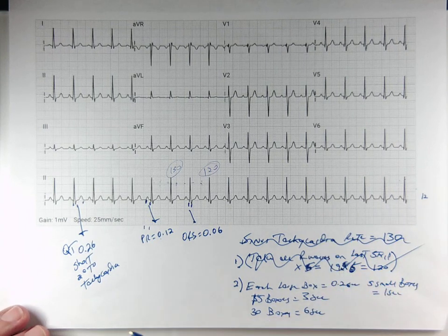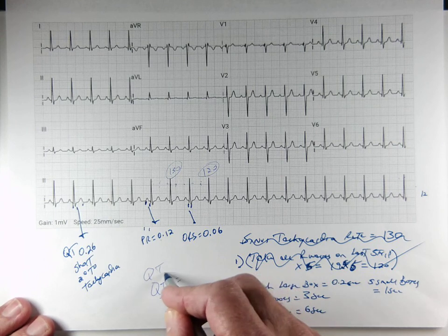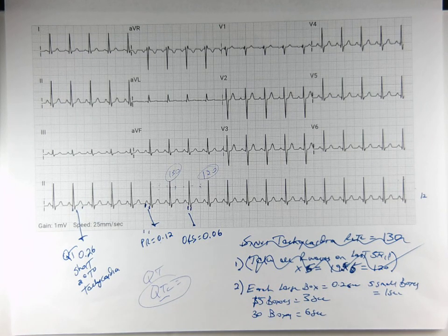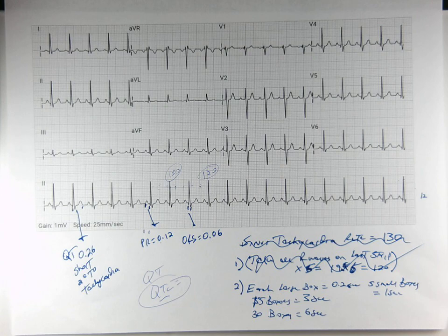And so when you get a printout from the EKG, you'll see up on the top, it'll say QT, it'll say QTC. The QTC is corrected by the machine for the heart rate. And we're generally in that 0.36 to 0.46 range, kind of ish, as sort of normal. It's calculated basically, the non-corrected is what it would be at a heart rate of 60. That's what we correct for. What would it be at a heart rate of 60? So if you're 120, it'll correct it, tell you this is the corrected QT as if your heart rate was 60, which is our standard. Okay? All right, end of that talk. Thank you.